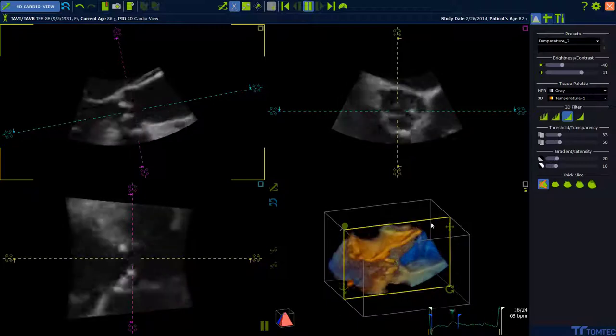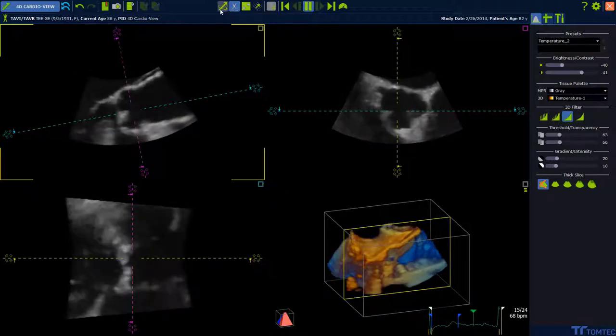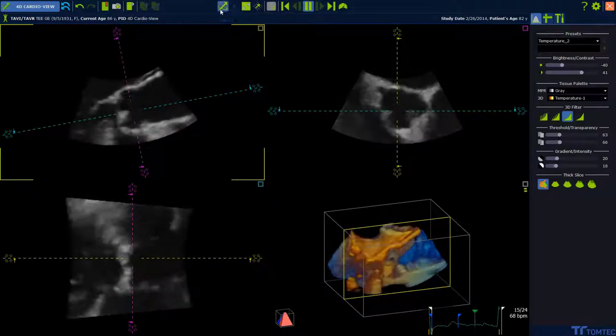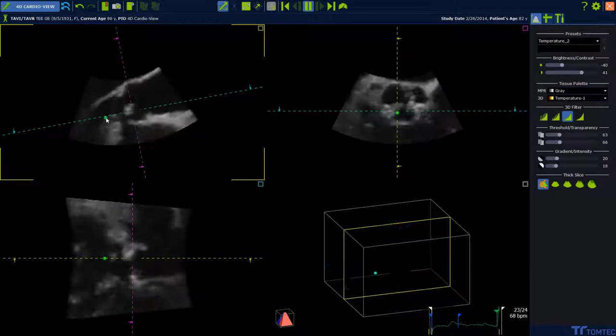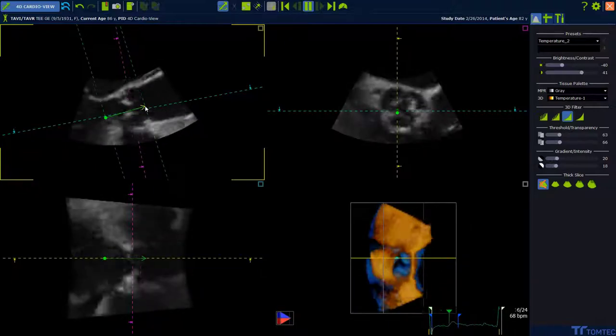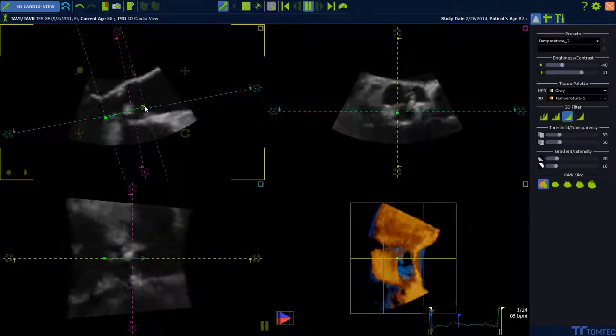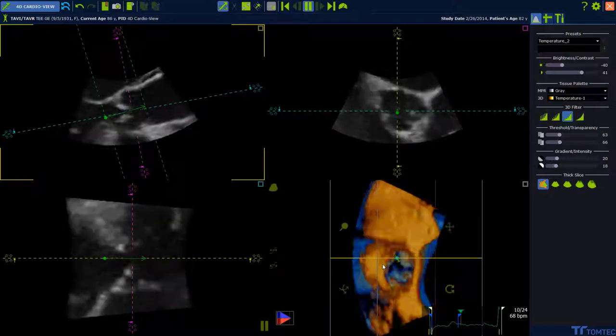How to use the D-Art. Click on the D-Art icon and set two distance points at one of the displayed 2D views to define the region of interest in viewing direction for the 3D view.